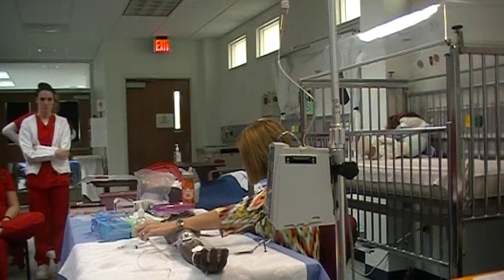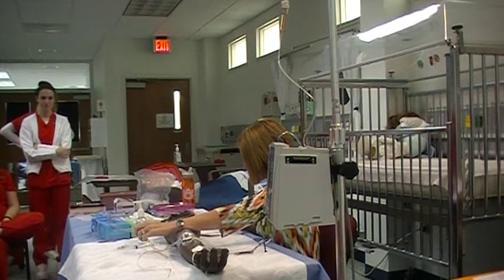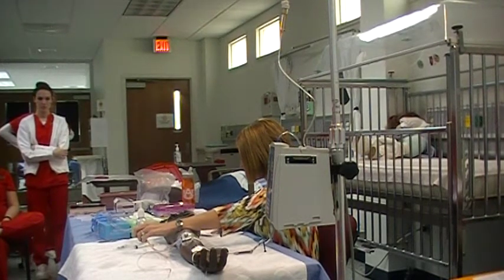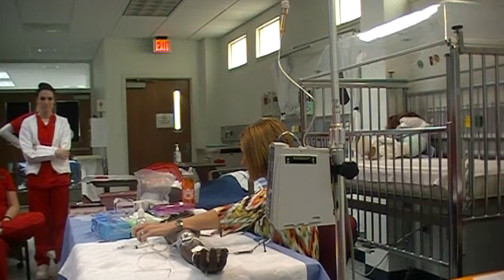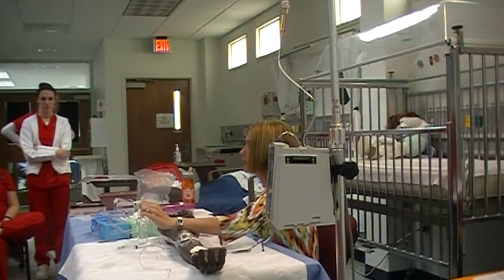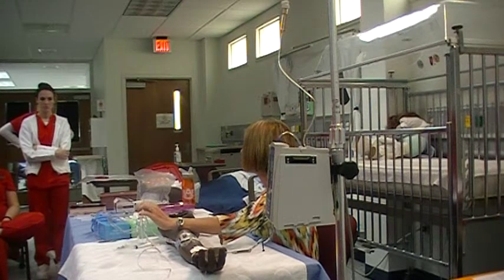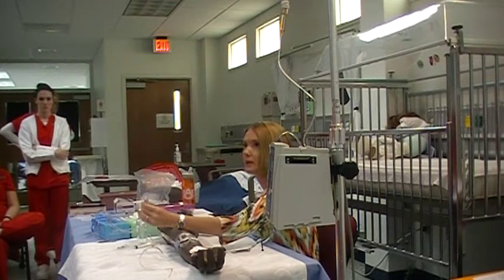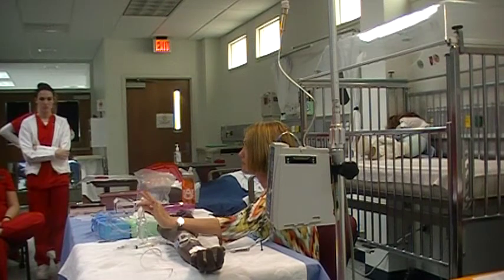to our existing line. We flushed with 10. Let me make sure I'm doing the right one here. Existing line, compatible. So clean the injection ports, occlude the tubing. Do you see how I've occluded that tubing? Because we don't want it to flow back into the bag. So we have to occlude the tubing, and this is exactly how I hold it usually, or something to this effect.